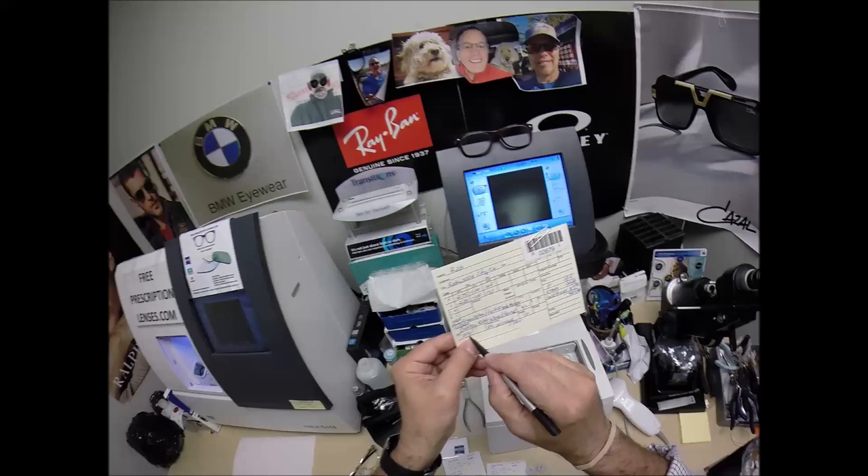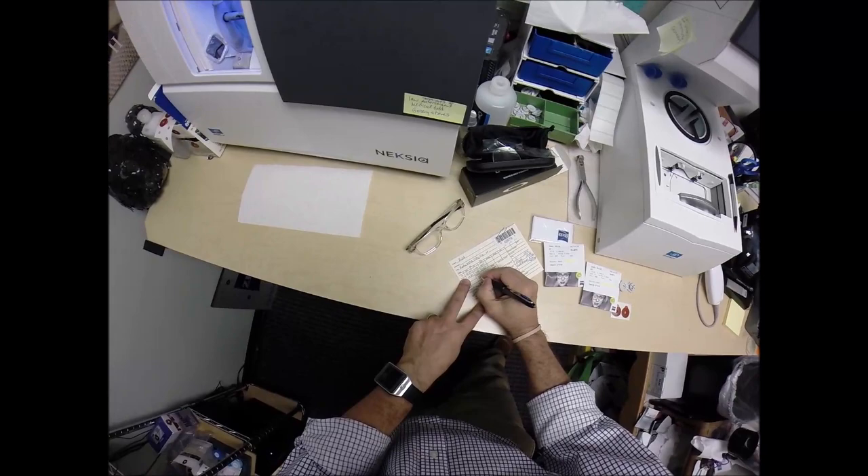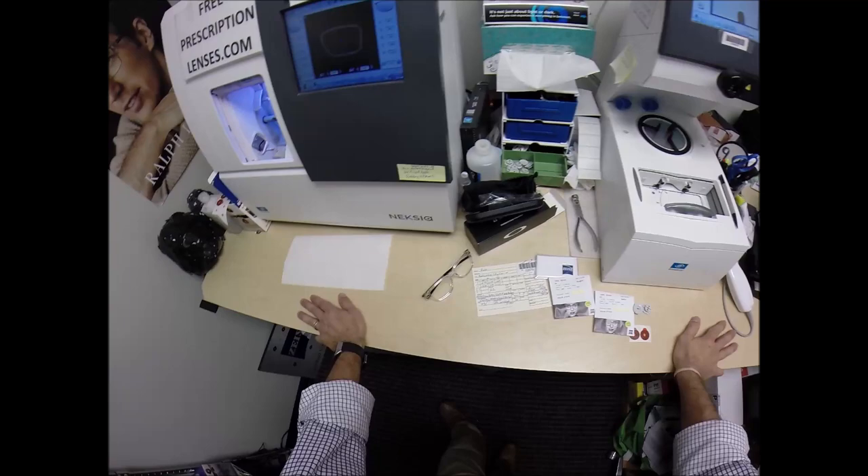Let's go ahead and enter your pupillary distance, which is 63 total — that's 31.5 for each eye. I'm going to raise the optical center height up to 22 and write that on there. By the way, I got ahead of myself — I need to step back.